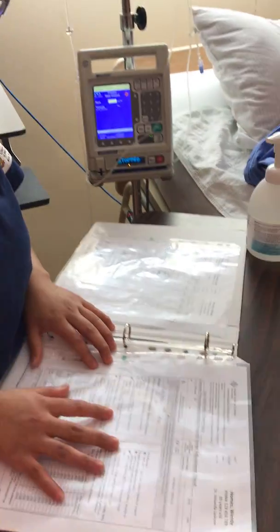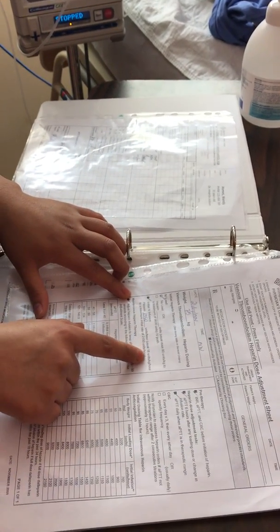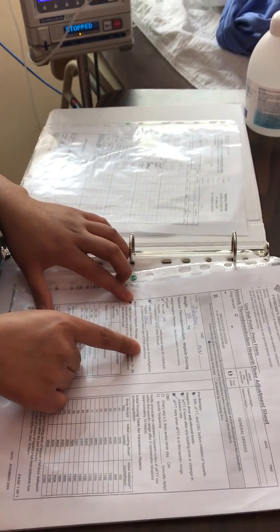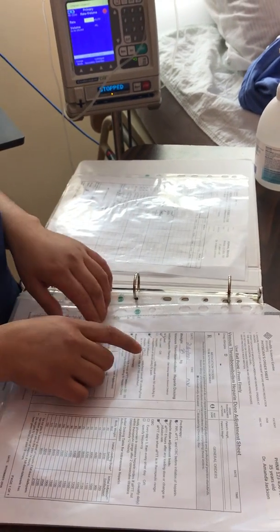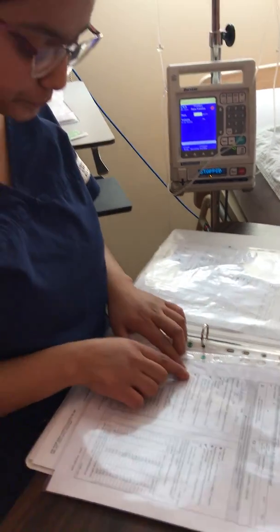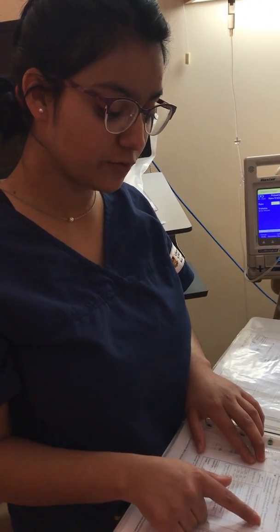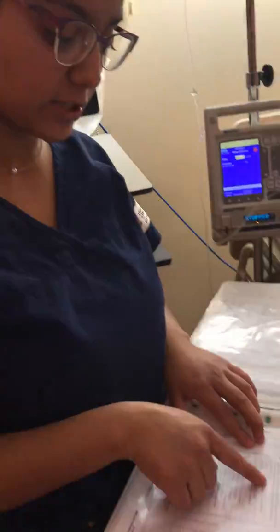My MAR says that heparin is 1350 units per hour, usual 18 units per kg per hour to a maximum initial rate of 2150 units per hour. My patient weight is 75 kg, and I've already checked that this calculation is right. I have to adjust the heparin infusion to keep the APTT between 59 to 99 seconds according to the IV heparin dose adjustment scale.